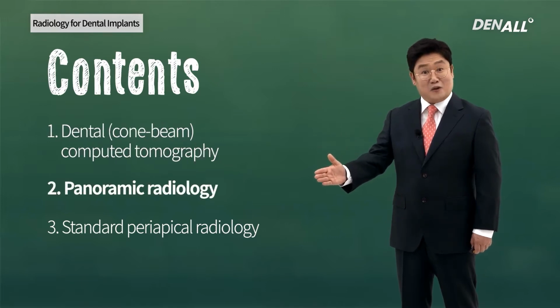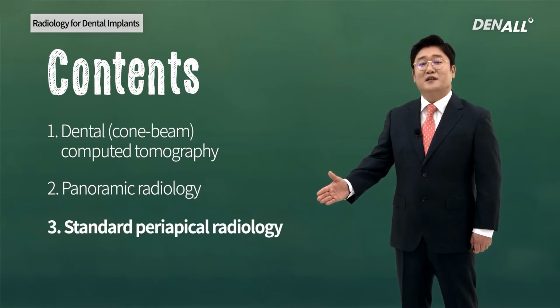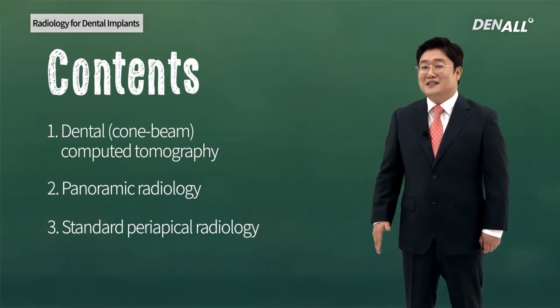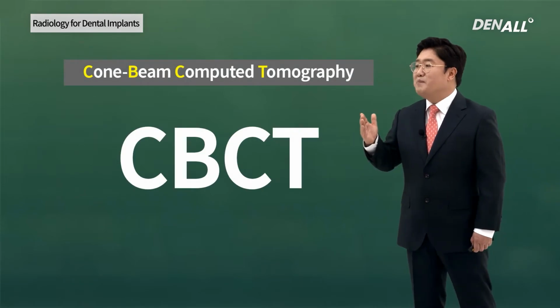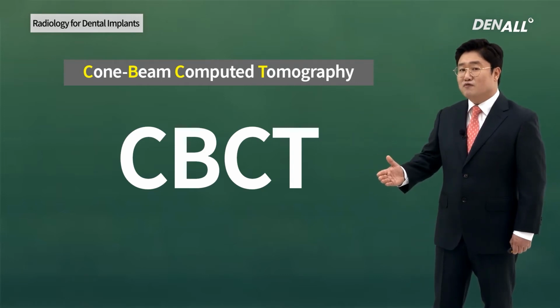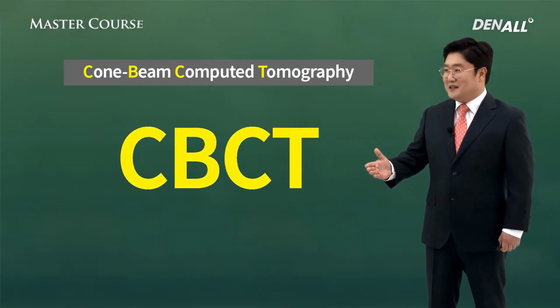Panorama, which you already know well. 3. The standard or standard periapical radiology procedure. First, cone beam computed tomography. It is abbreviated to CBCT.